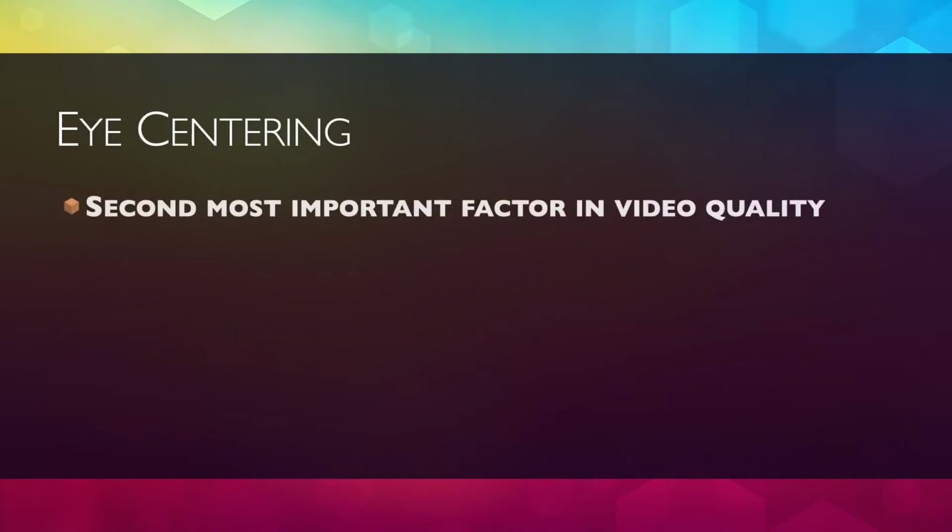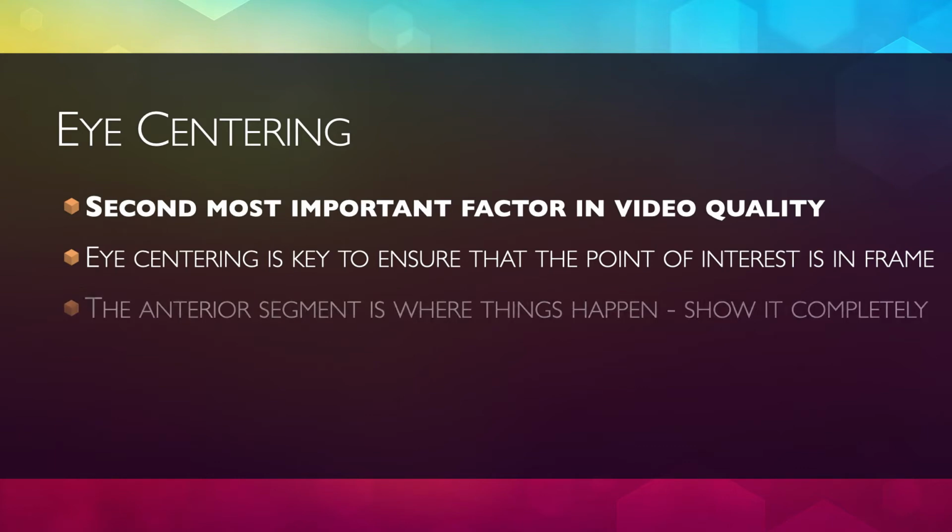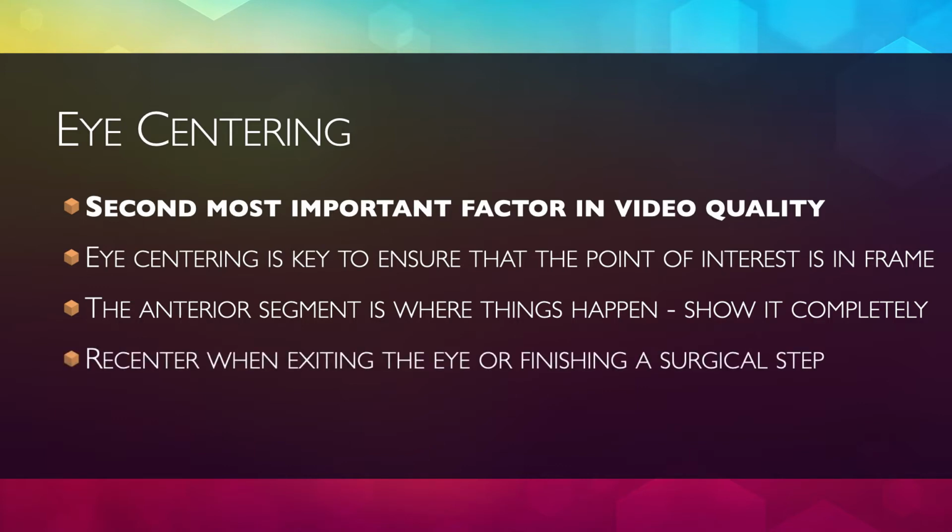I consider that centering the eye is the second most important quality factor. The anterior segment should always be completely in the frame. This can be very challenging in uncooperative patients, though. Sometimes the eye ends up drifting, and here I have an editing tip.